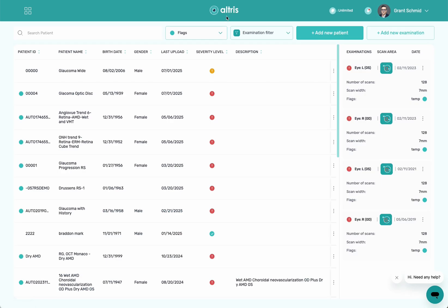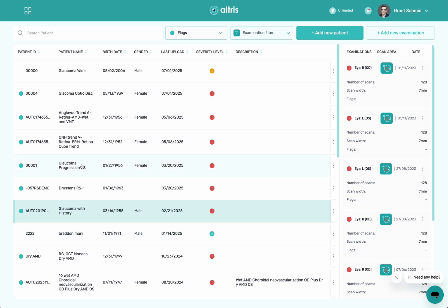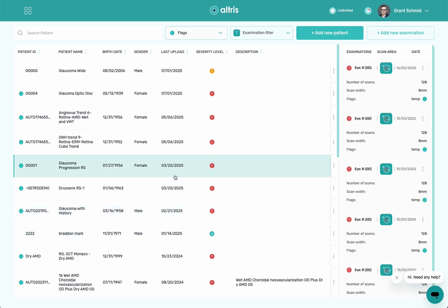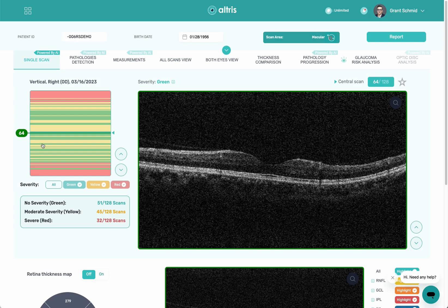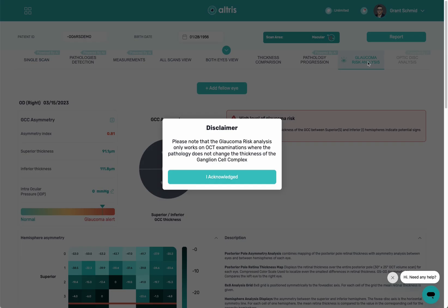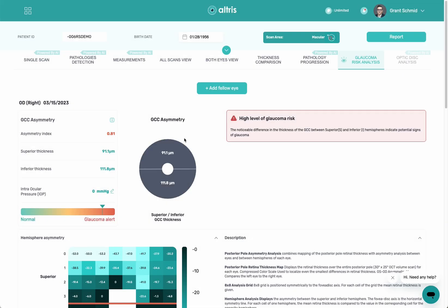From here I'm going to change and go into a glaucoma patient. It's a macular scan showing they've got some drusen in those scans. When I go into this one, I've got that same traffic light system — you can see there's some activity. But I also have this glaucoma risk analysis now. When I go into this, I have the ability to look at ganglion cell symmetry by hemisphere and see if there's something going on.